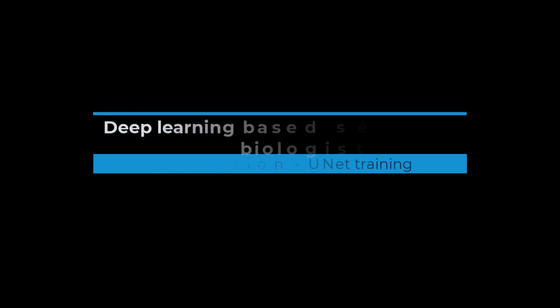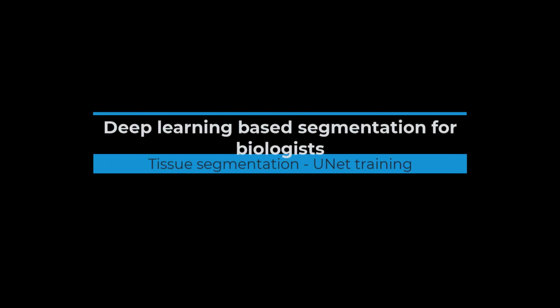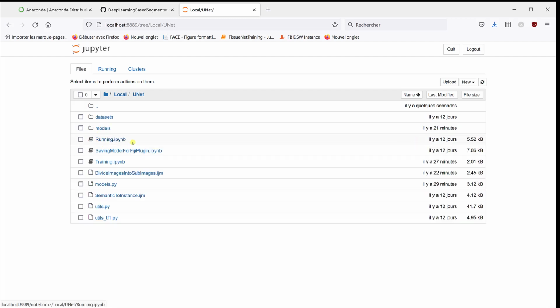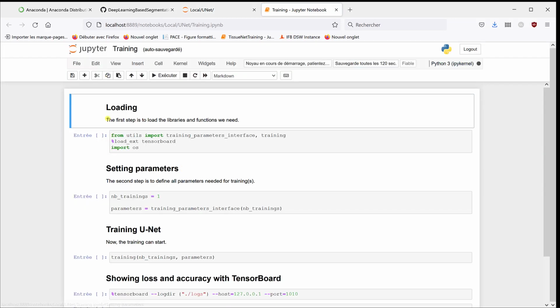In this video, I'm going to show you how you can train a UNet model for segmenting epithelium in stroma. So if I go back in my Jupyter environment, I can go to local, UNet, and I'm going to open training, now that the data set for epithelium and stroma is ready, what we did in the previous video.